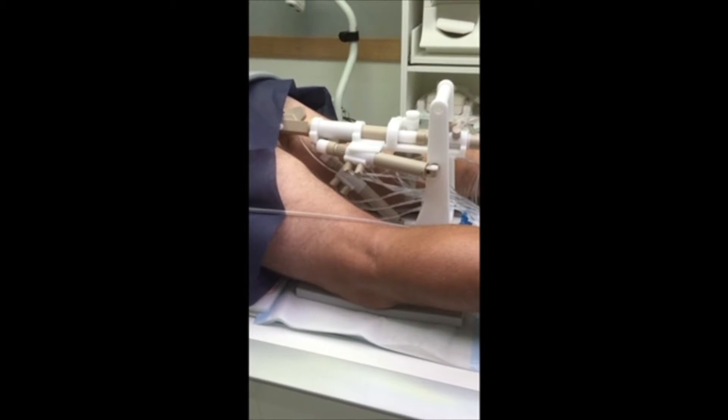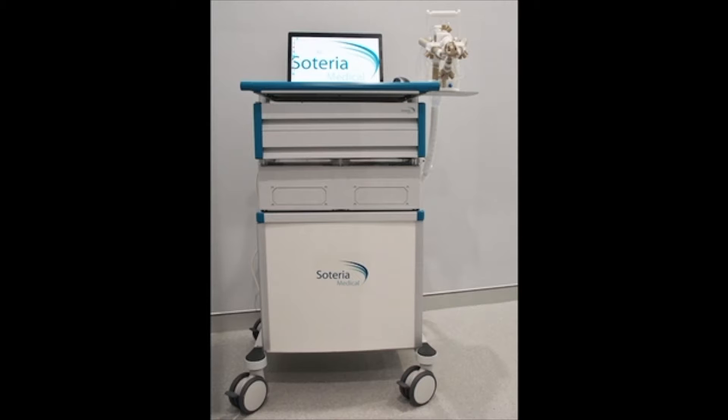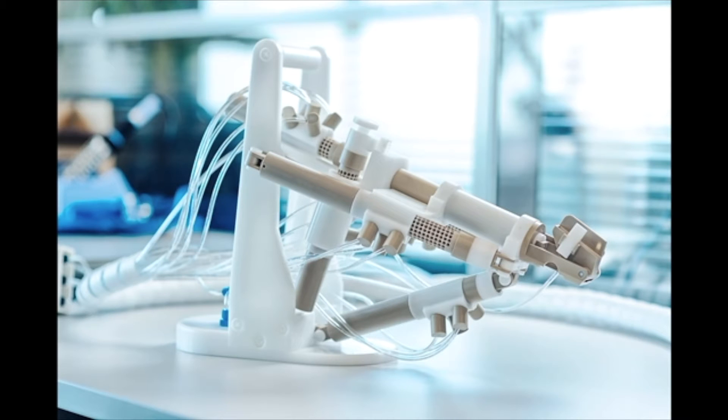The patient is positioned face down with the probe in the rectum. The robot is seen here sitting beside the laptop which controls it on the stand. This is the robot which is made of plastic and controlled by compressed air to allow it to be in the MRI.